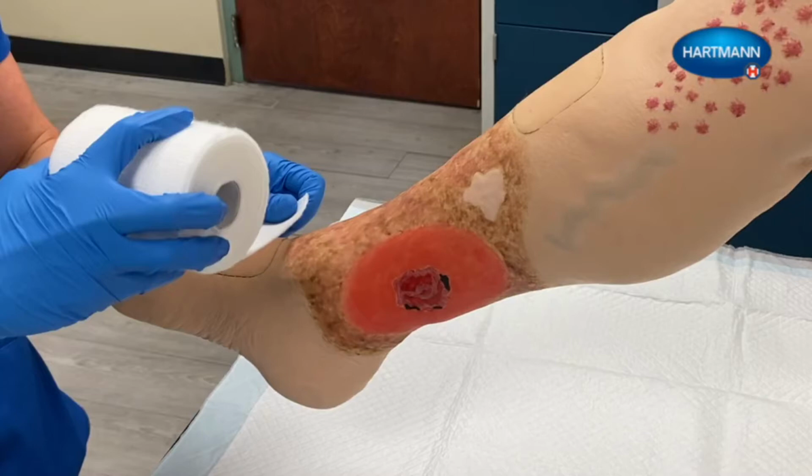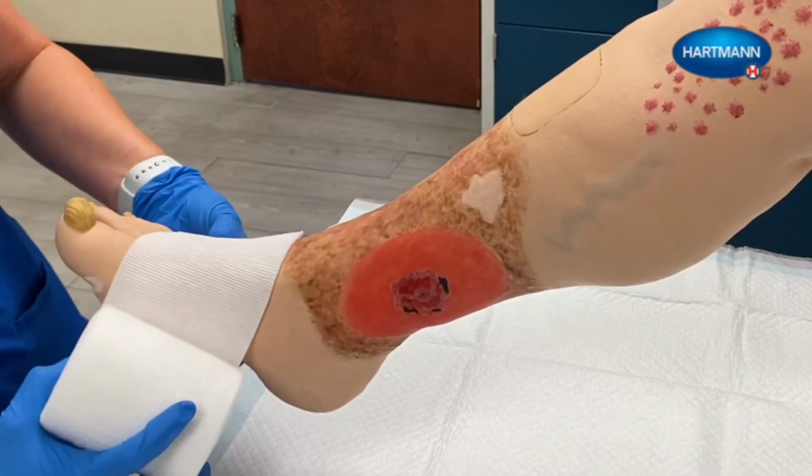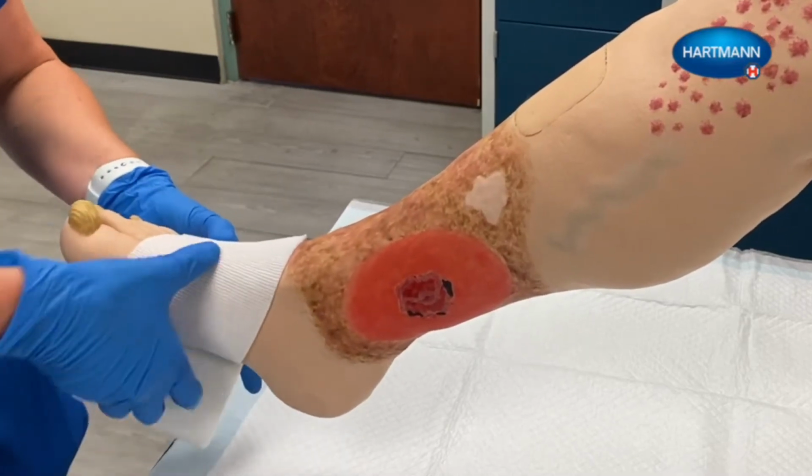When applying the two bandages, make sure that the patient's foot is at a 90-degree angle to the lower leg. Layer 1 is a short stretch padding bandage which is thin and air permeable. Hold each bandage as shown so the bandage unrolls flat against the foot. Start with the non-cohesive side against the skin, proximal to the base of the toes.